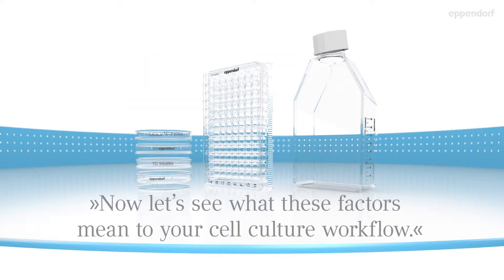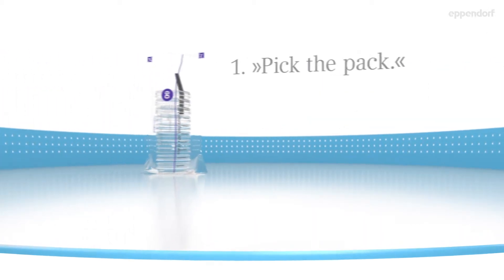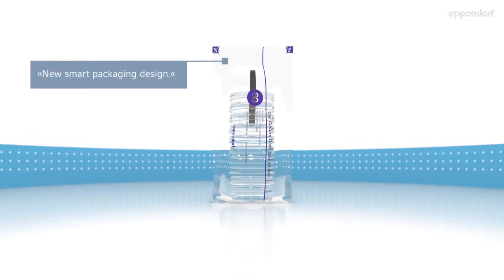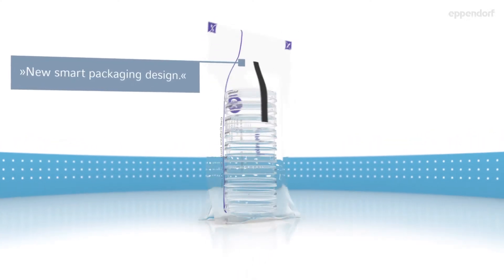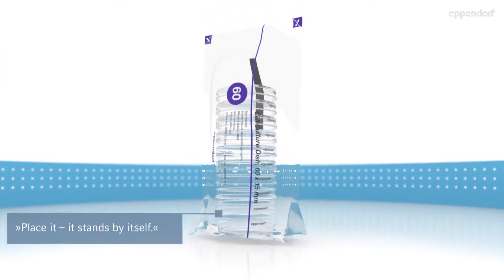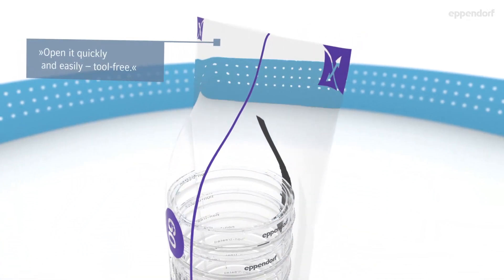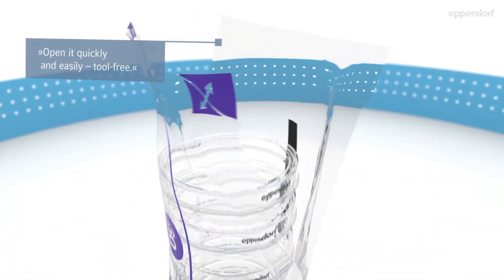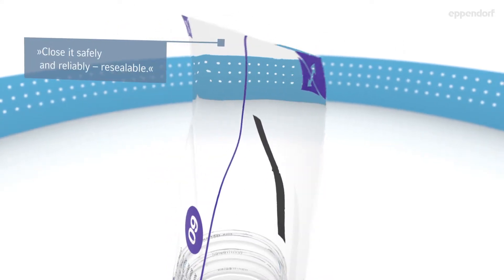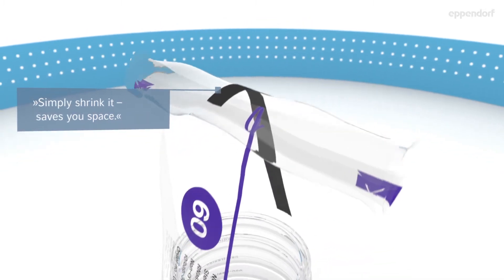Now let's see what these factors mean to your cell culture workflow. Pick the pack — new smart packaging design. Place it: it stands by itself. Open it quickly and easily, tool free. Close it safely and reliably, re-sealable. Simply shrink it — saves you space.